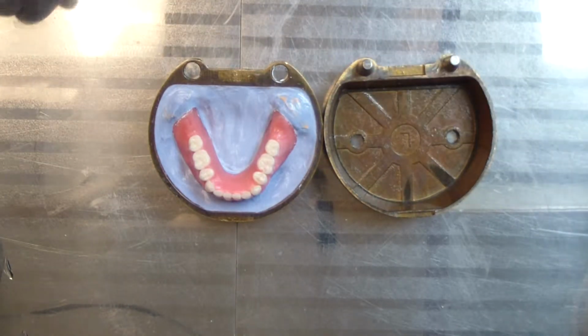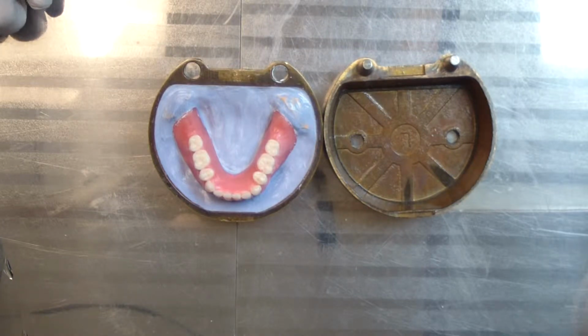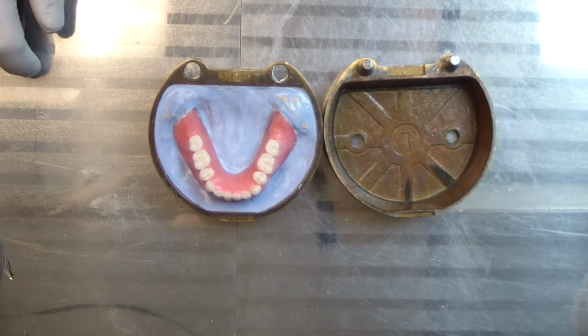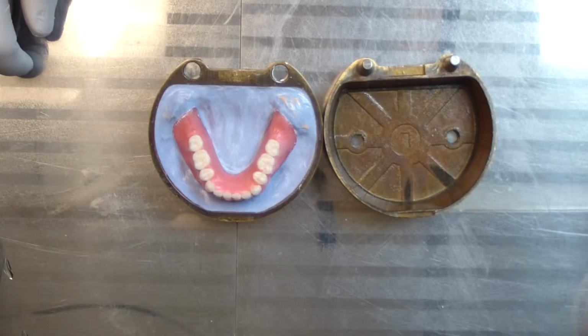I've been using different kinds of stones over the years and different kinds of techniques. I've used just a regular buff stone, or I've used rapid flask from Whip Mix, and I've had good results somewhat with everything. Haven't had really any major issues. My only concern with just regular stone was that the replication wasn't as good. I would be trapping some air. You'd have to use vibration.